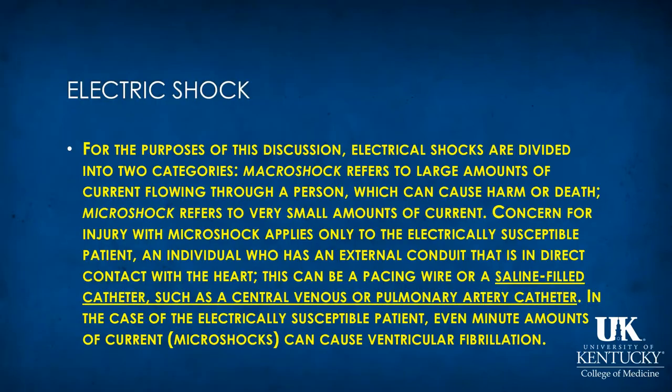For the purposes of this discussion of electrical shocks, I want to reiterate that macroshock refers to large amounts of current, although not large in terms of the capacity of the circuit, just large relative to the very small amounts that may be occurring through saline-filled catheters, such as a central venous catheter or pulmonary artery catheter.